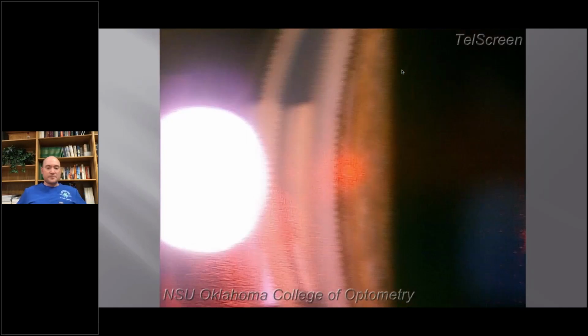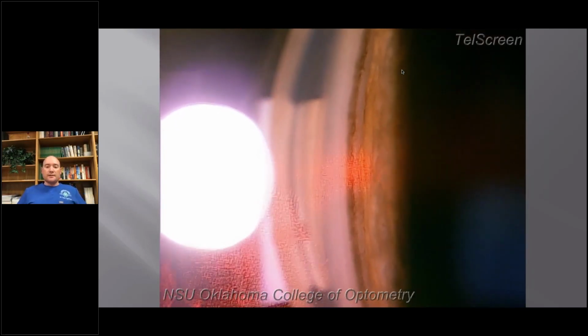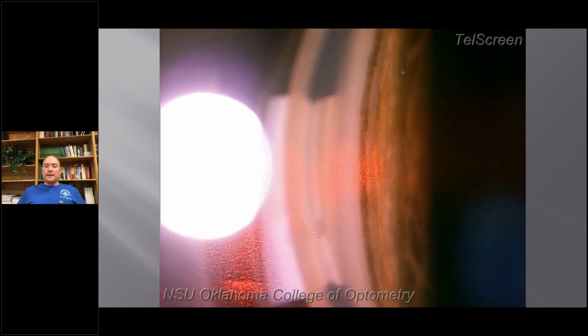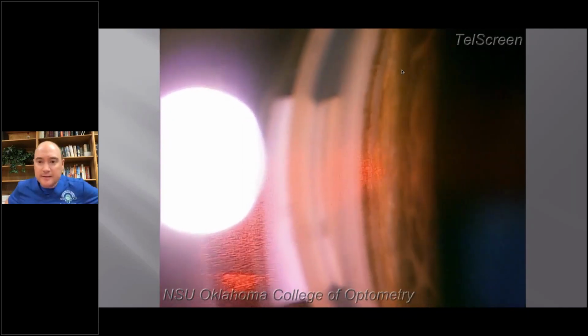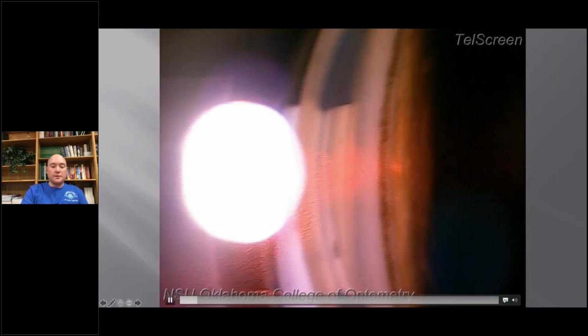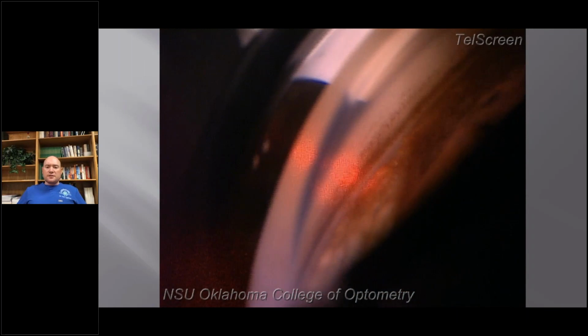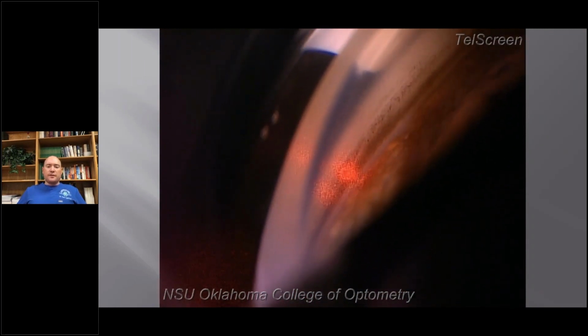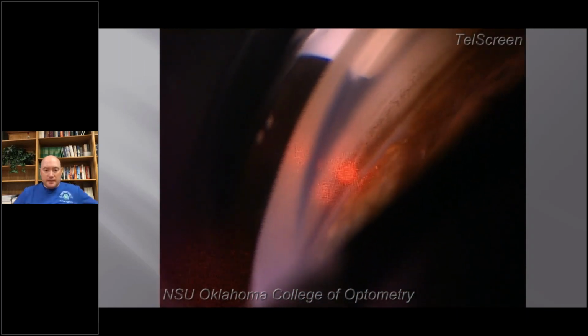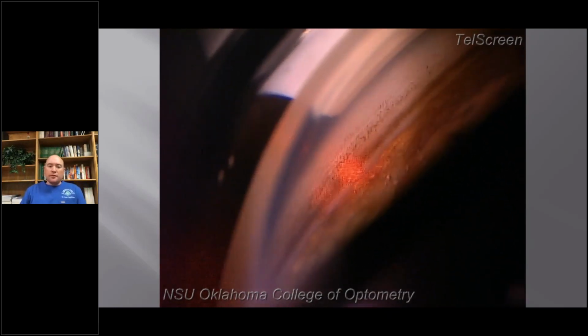Let's watch a couple of videos in our last 6 minutes here before we start our question and answer. So this is an SLT. I'm going to fast forward this just a little bit. There we go, up to this quadrant here. This is an SLT that I did in 2013 or 2014. You can see a nice view here. We've got our 1 aiming beam. And you'll notice nice view, just covering the trabecular meshwork.